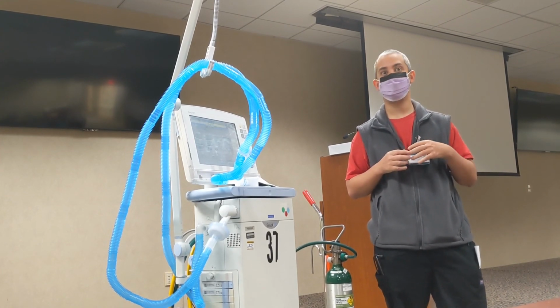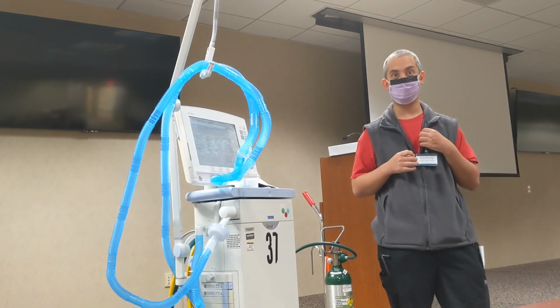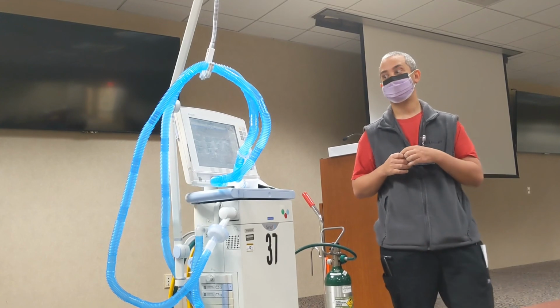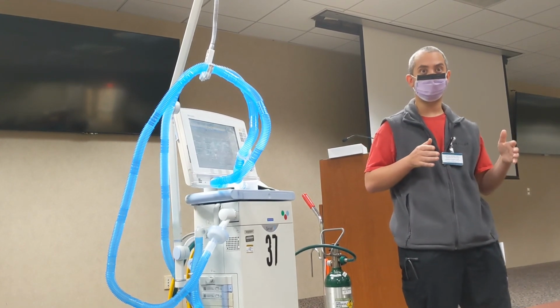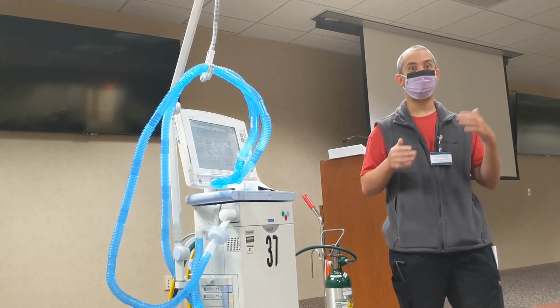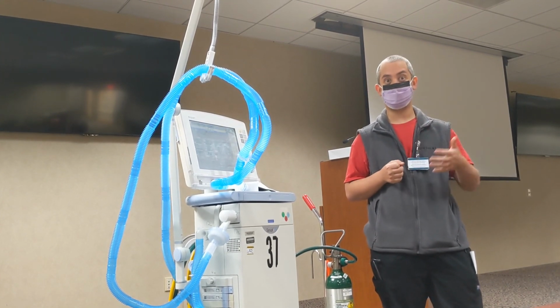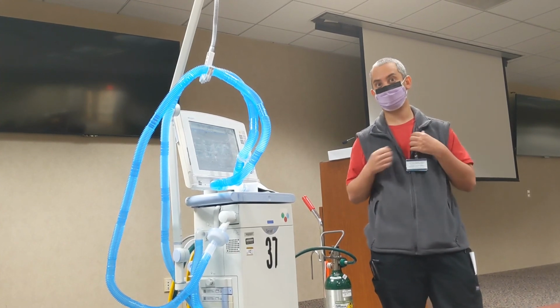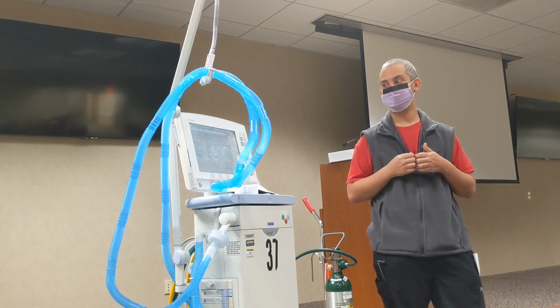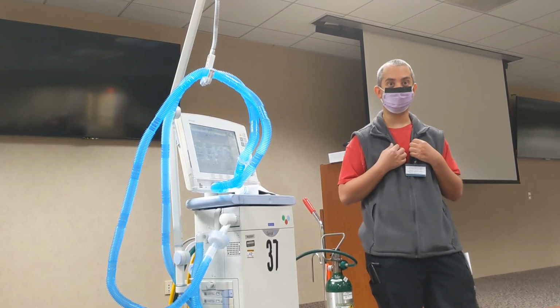But if you notice that you were really hypercapnic, your PCO2 went up to 100 and their oxygenation wasn't great, then yeah, by shortening your T high and increasing your P high, if you're doing multiple things at once, and if they're that critical that their numbers are that bad, then yeah, about another half hour to hour after. As long as you realize the oxygenation part may lag a little bit behind.